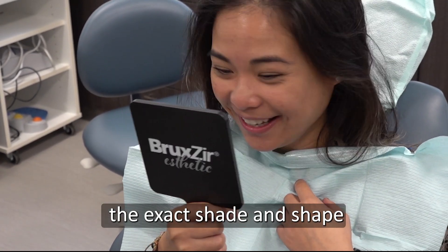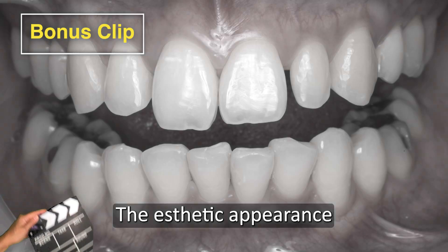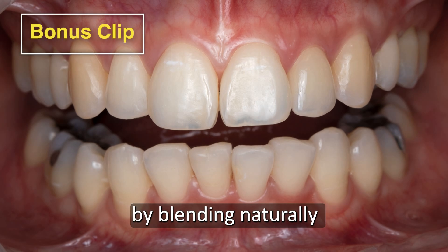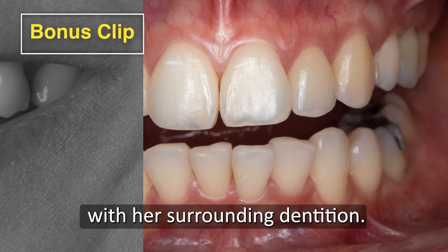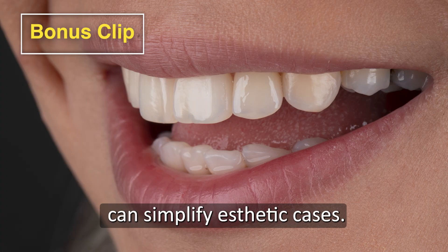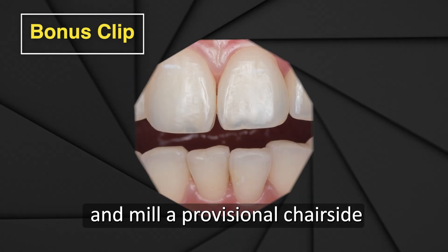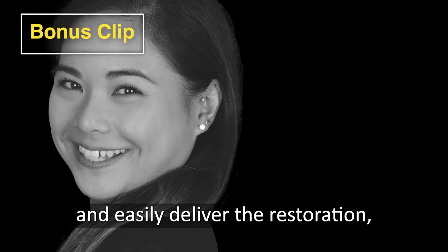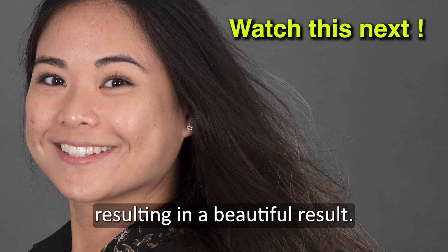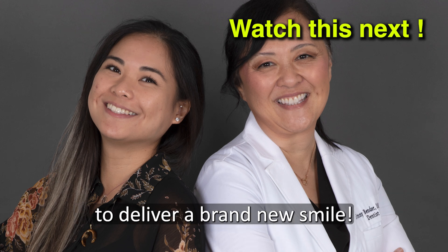The results show that the lab matched the exact shade and shape that the patient had always wanted since she was a child. The aesthetic appearance of the Obsidian crown exceeded her expectations by blending naturally with her surrounding dentition. This case report demonstrates how digital chairside workflow can simplify aesthetic cases. The ability to scan a patient, design a crown, and mill a provisional chairside, then easily deliver the restoration, allowed me to personalize the treatment plan with greater flexibility, resulting in a beautiful result. I was so happy to reconnect with my former patient to deliver a brand new smile.